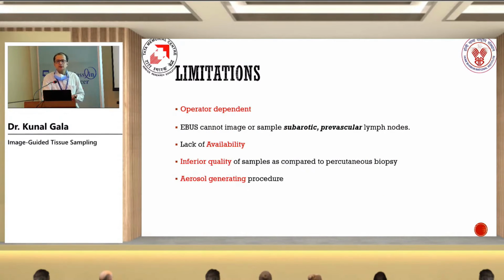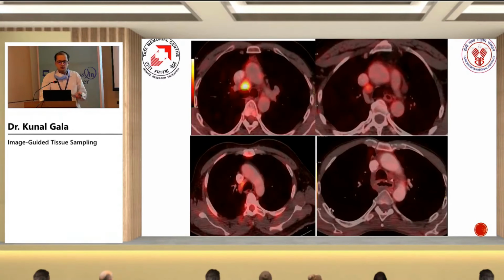A limitation, obviously, as with ultrasound, is that it is operator dependent. It cannot target subaortic or prevascular lymph nodes because they are situated anterior to the vessels, and there is a lack of availability at all places. The cores are inferior as compared to percutaneous biopsy. And it is an aerosol generating procedure, so during the COVID times, you can't do the procedure.